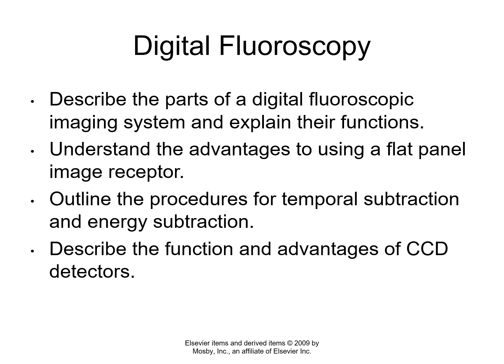And usually with an upgrade in image receptor technology, you get a lowering of dose, and that's also true with digital fluoroscopy. So we're going to talk about a digital fluoroscopy system, not all of them built the same. Again, you can have an image intensifier system that's been converted to digital fluoroscopy by just including a CCD on the output phosphor rather than a conventional television camera. We're going to talk about the advantages of a flat panel image receptor over an image intensifier, procedures for temporal and energy subtraction. Okay.